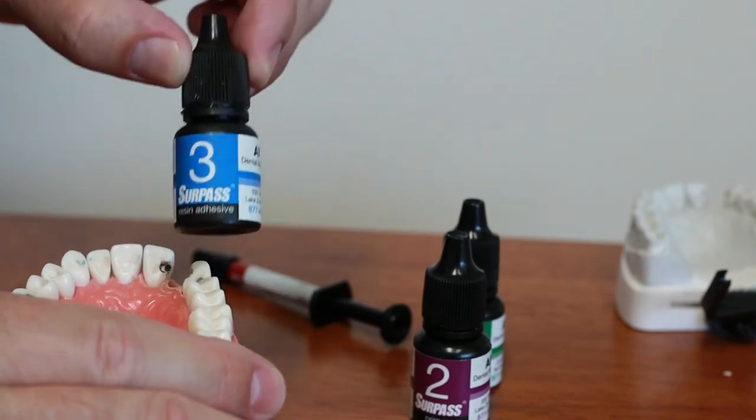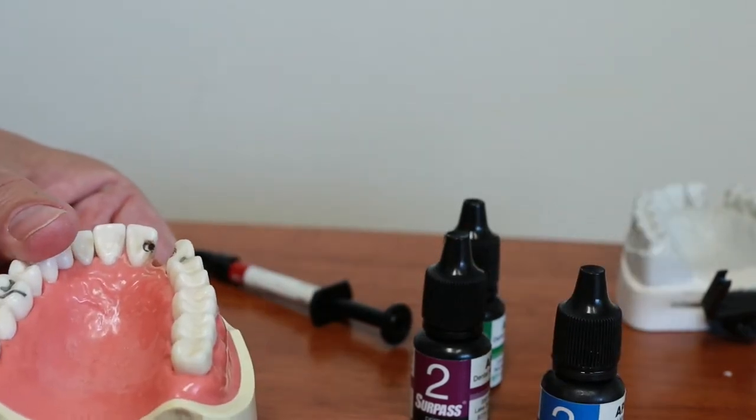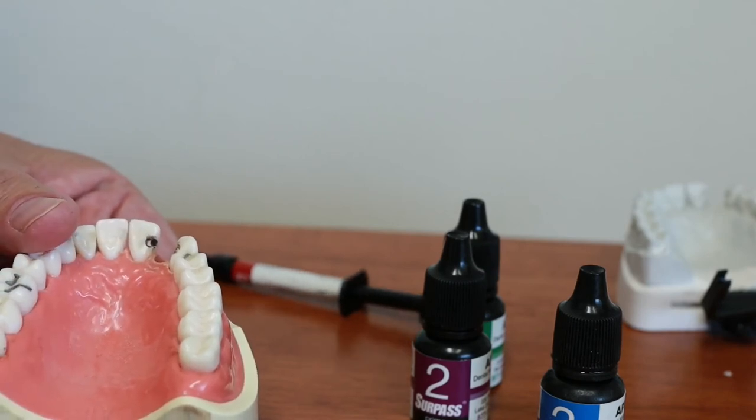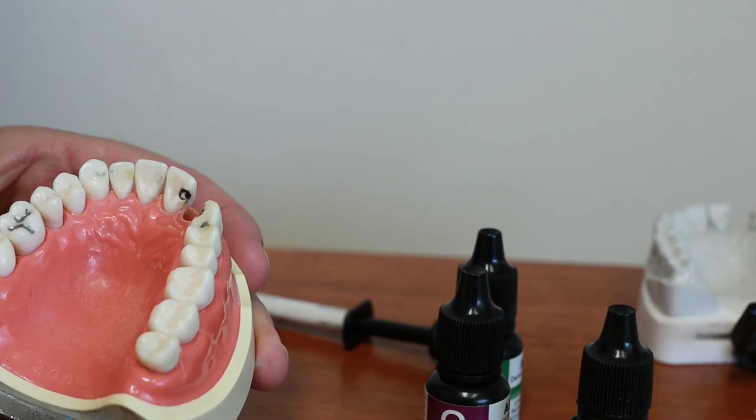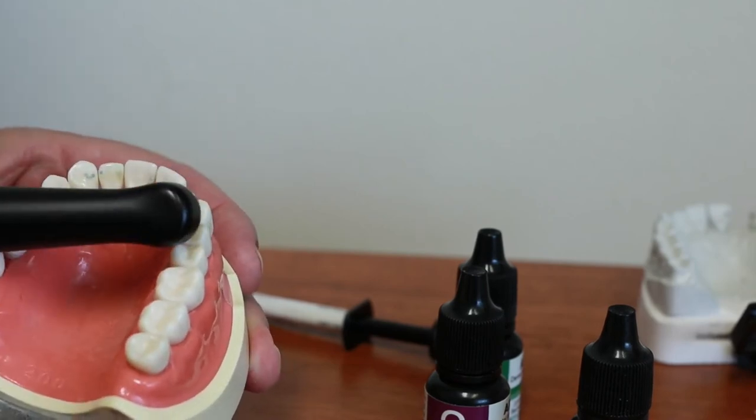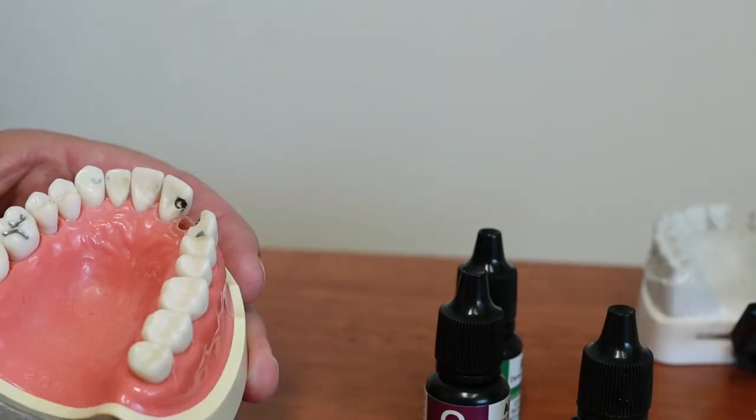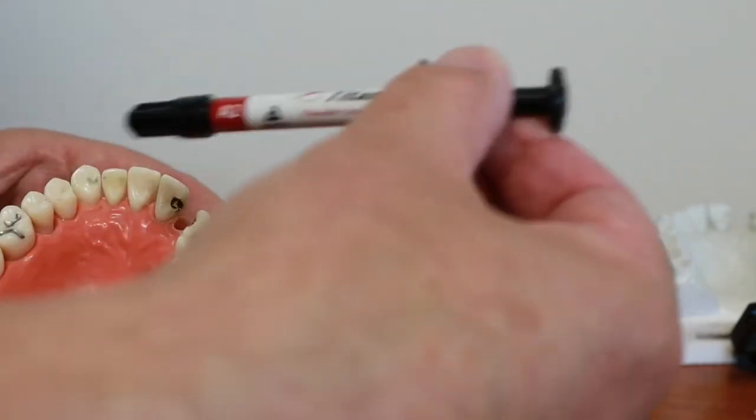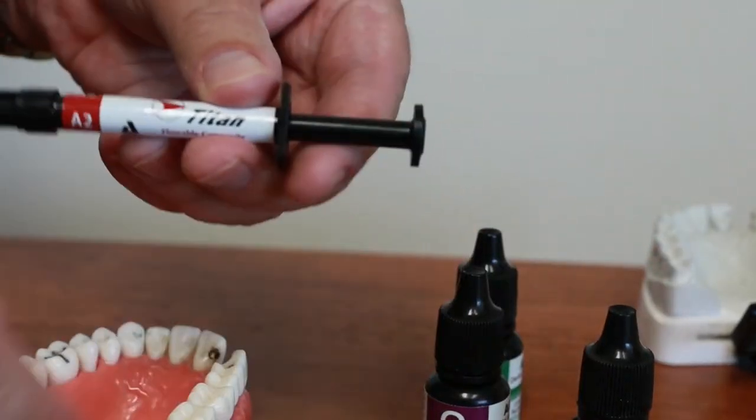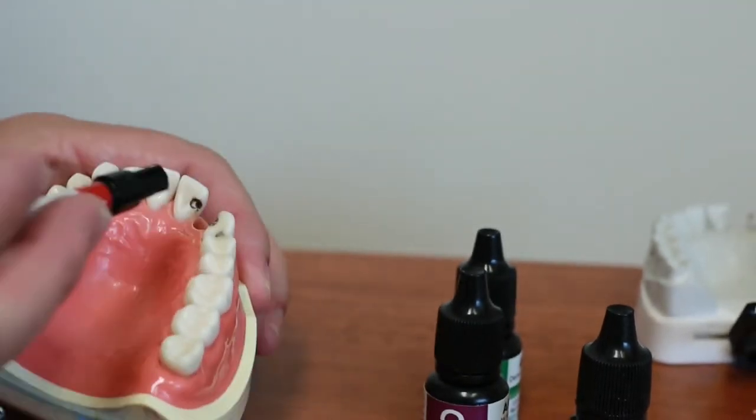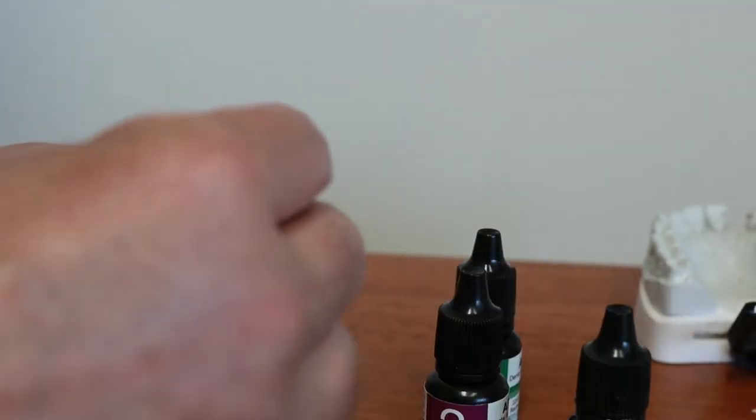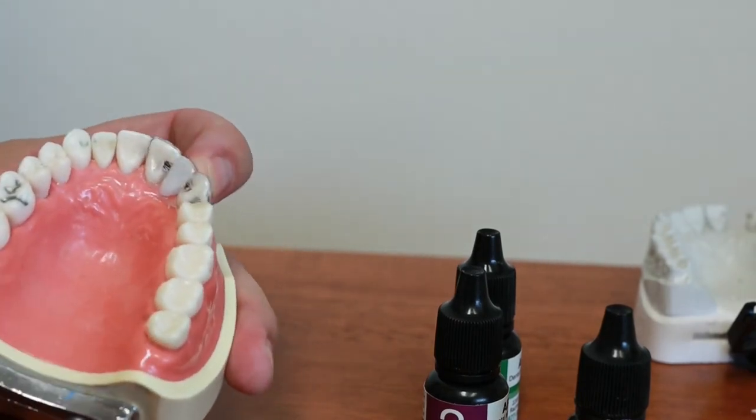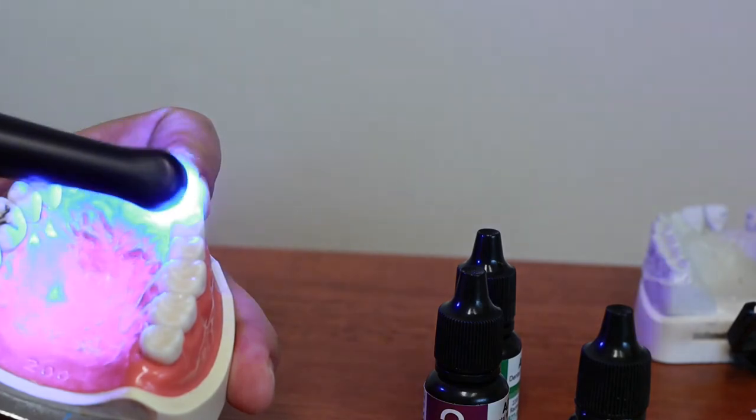With the Surpass system I will zap it with my curing light, just a blue light, set it up. Once it's set up I'll use some flowable composite. I use Titan, the brand I use is called Titan, again made by Vista Apex. Put a little bit in each prep. Take the Maryland bridge, set it in place. Put the prep guide over it just to make sure the bridge is in the correct spot. And then I'll zap it with my light again for another ten seconds.